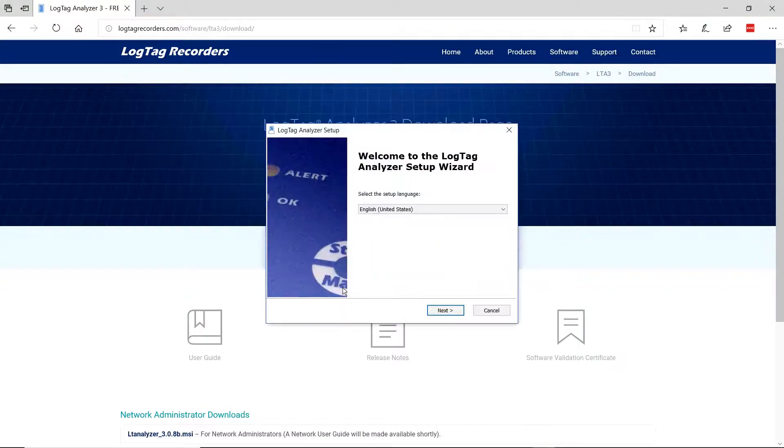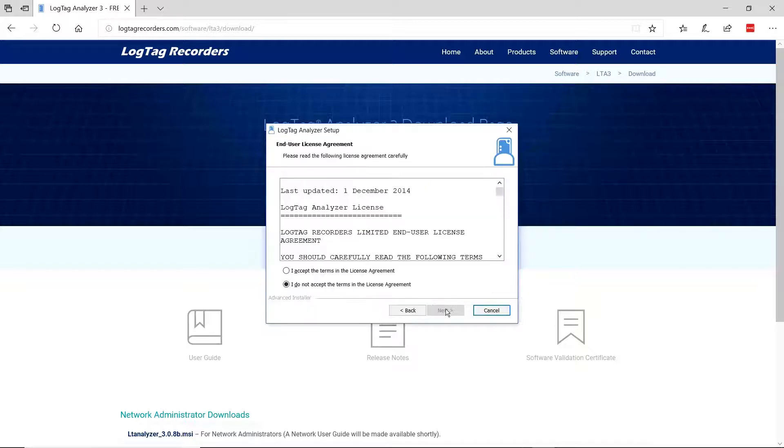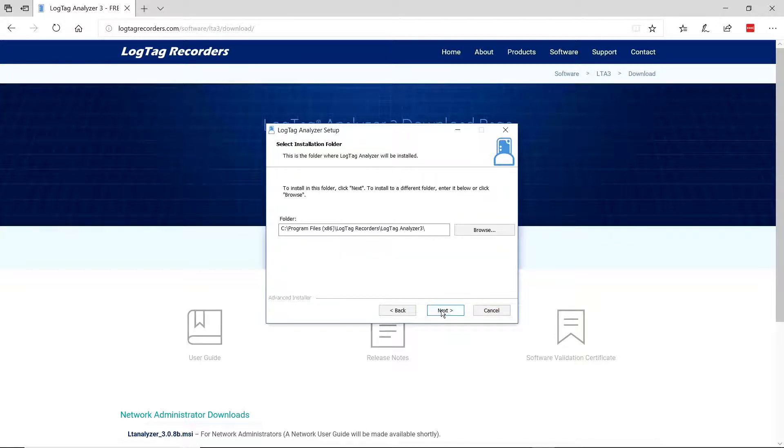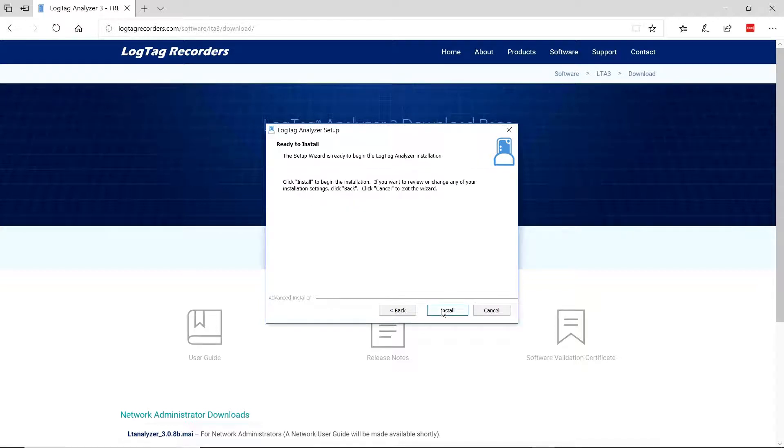Click Next through the prompts. Click I Accept the Terms in the License Agreement. Continue clicking Next and then click the Install button.